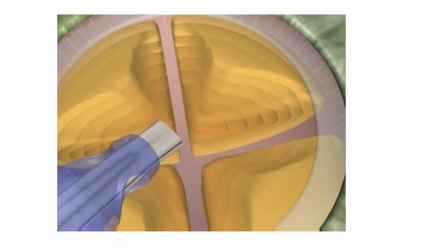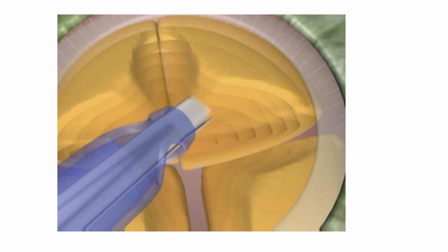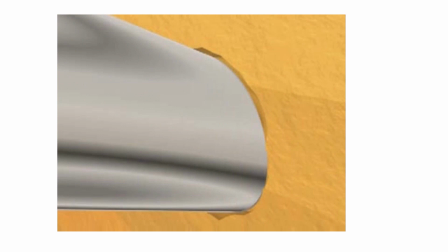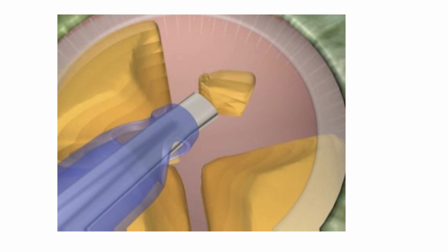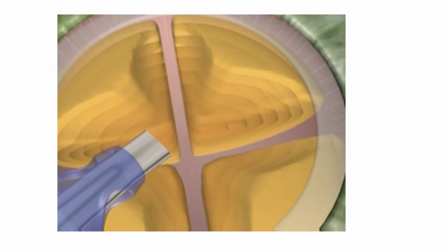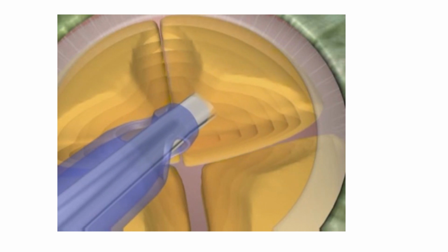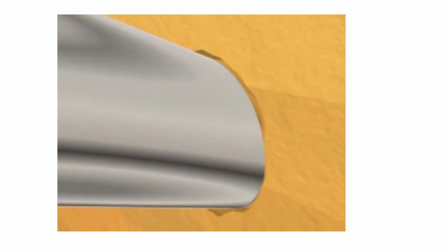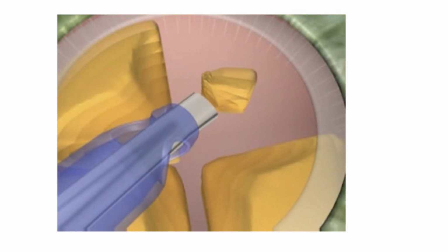As the repulsion or chattering of the nucleus pieces takes place, it takes a longer time for the surgeon to emulsify the pieces from the eye by building the fluidics back again, because if things are moving away from the phaco tip, you need to build the fluidics again, have more aspiration, compensate with more irrigation, and bring those nucleus pieces back again to the phaco tip, right? So that is why we cannot always increase the phaco power to its maximum limit.